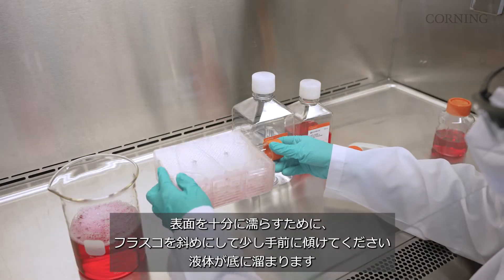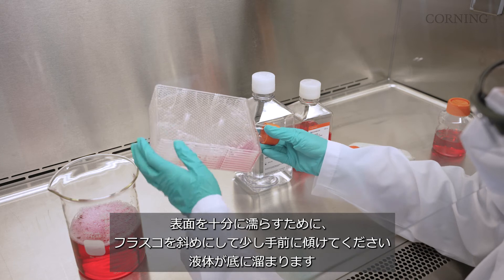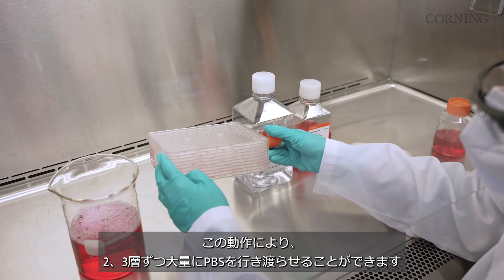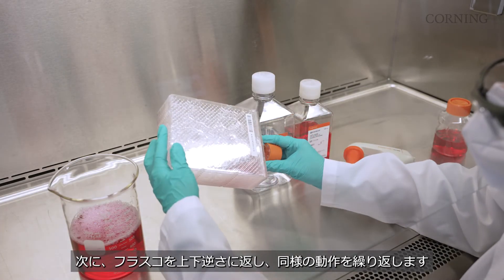To thoroughly wet the surface, tilt the vessel on an angle and slightly towards you. The liquid will concentrate on the bottom layers. This allows a greater volume to wet a few layers at a time, then flip the vessel over and repeat wetting the opposite side of the flask.